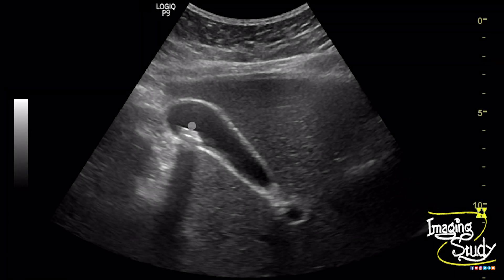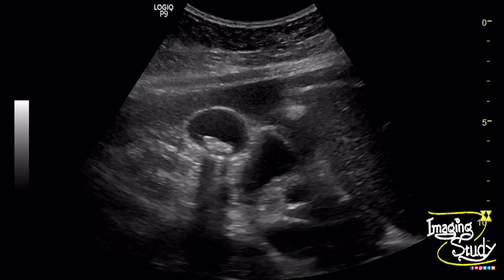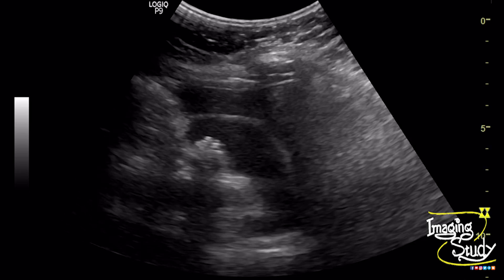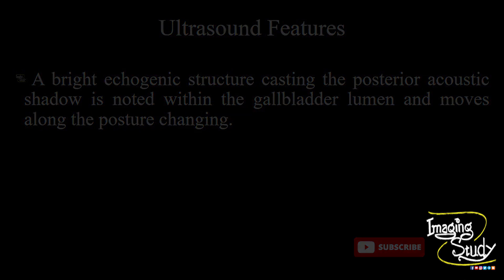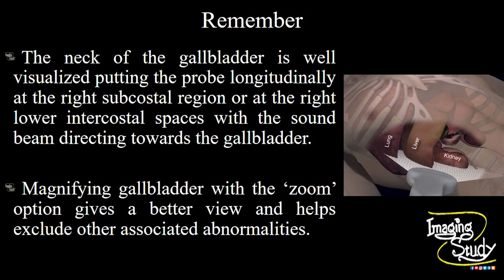Here is the image of this stone within the gallbladder lumen casting posterior acoustic shadow in longitudinal and transverse section. Here is the magnified image showing the irregular surface of the stone. In summary, a bright echogenic structure casting posterior acoustic shadow is noted at the gallbladder lumen, and this structure moves along with the patient's posture changing.